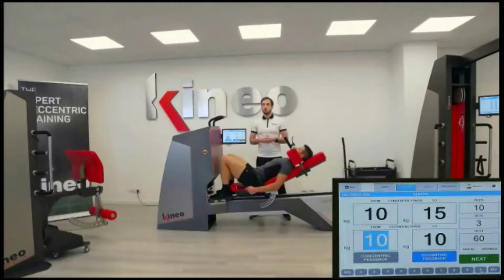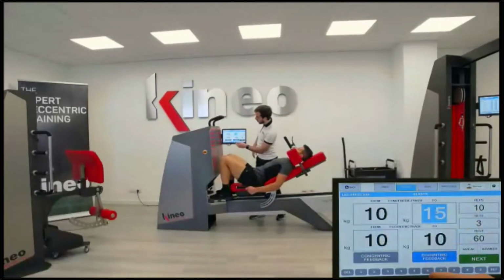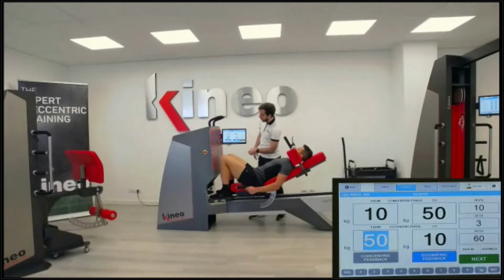Okay, one other thing that I wanted to show you, because the elastic method is really one of the best ones to do it, is the jumps, the plyometrics in the leg press. So what we can do here is select 10 kilograms as before to 50, and going back 50 to 10. And this will be an elastic, and I will ask Damiano now to jump.